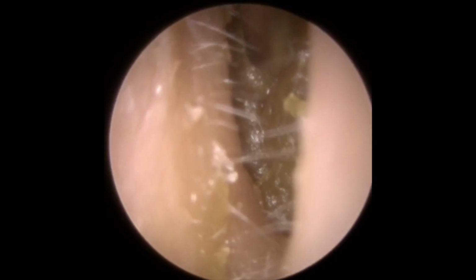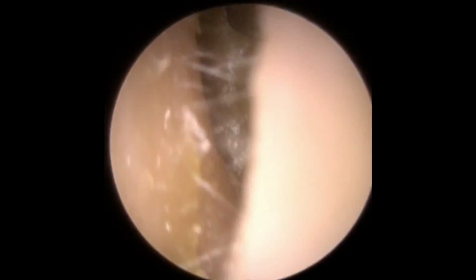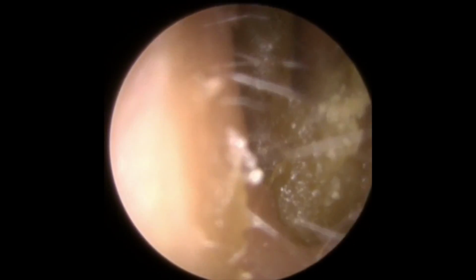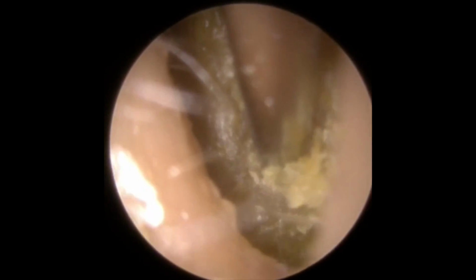So what we're going to do now is try and turn this. I'm trying to find a narrow edge, if we can, to try and maneuver it towards the outer part of the ear canal. But it's such an awkward shape and such a narrow canal, it's not turning. We can't wiggle it out because we can't get a good enough suction grip using the fine end. So I'm just pushing into the wax a little bit against the canal wall.